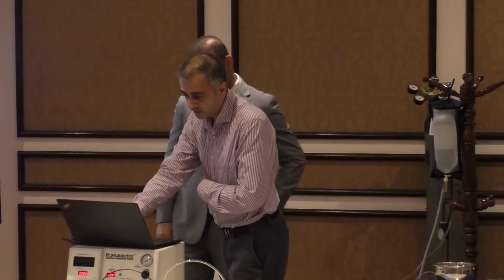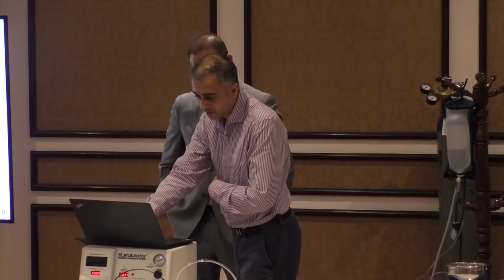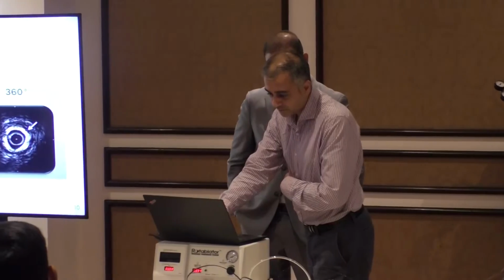Yeah. It's quite a complex question, but basically, the main imaging modality you have in Pakistan is IVUS, right? So let's talk about IVUS. In IVUS, if you've got just superficial calcium, go back a couple of slides to that view.